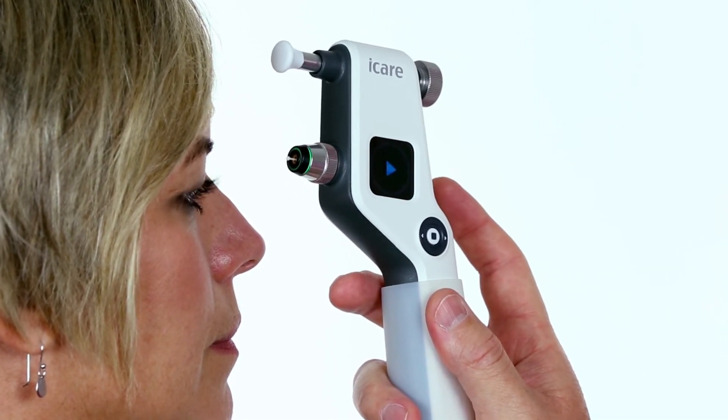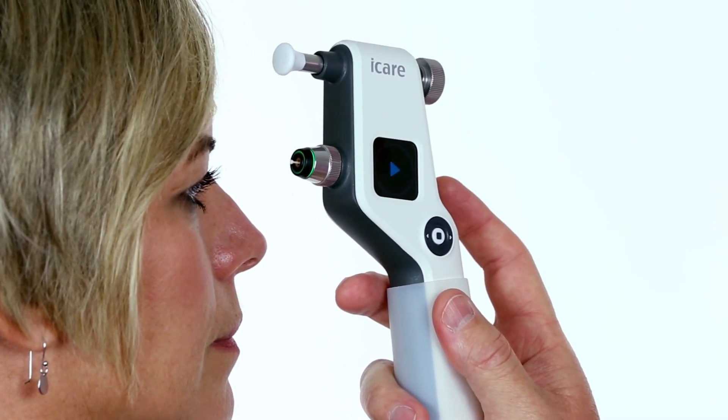Press the measure button once to clear the reading, and repeat the same steps for the fellow eye.